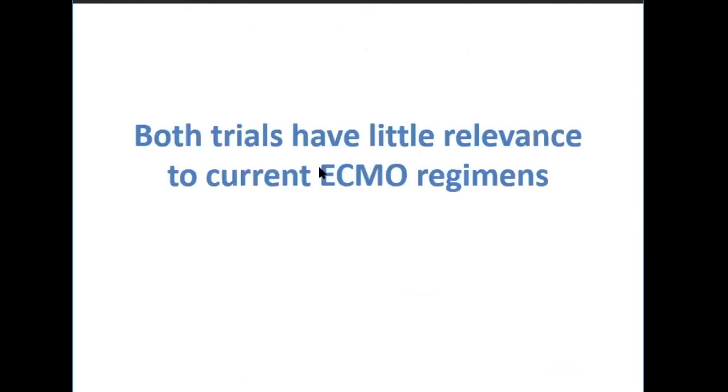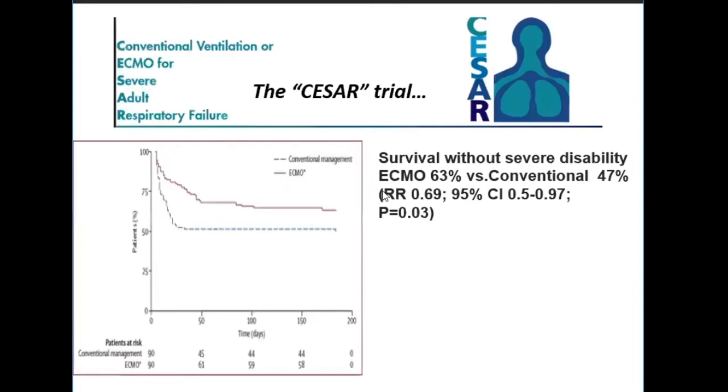But these trials have little relevance nowadays because a lot of changes have occurred in ECMO, and current ECMO is miniaturized, with fewer complications, less anticoagulation requirement, and less bleeding. The CESAR trial, which was published in 2009, is probably the first trial which showed survival benefit in ECMO patients.